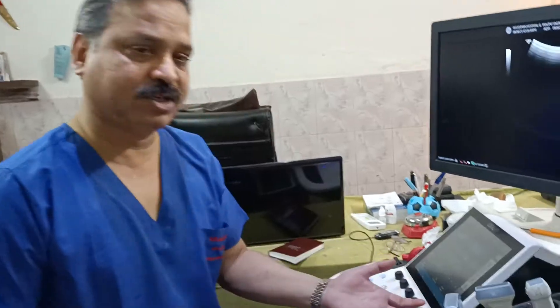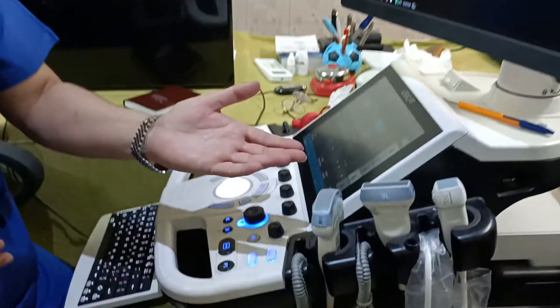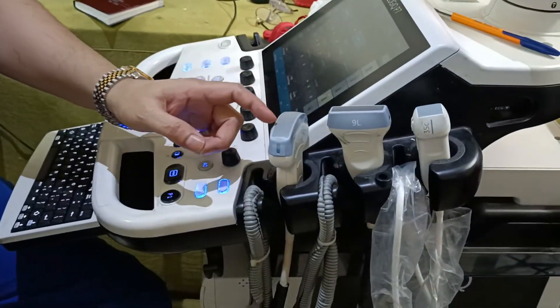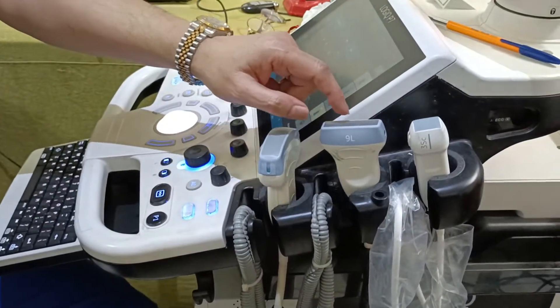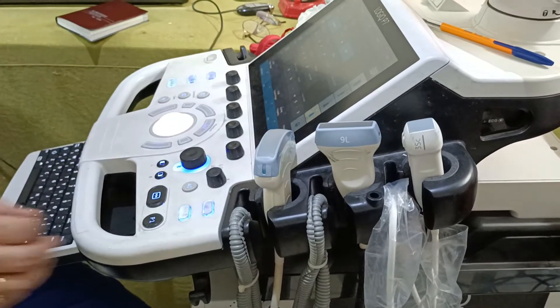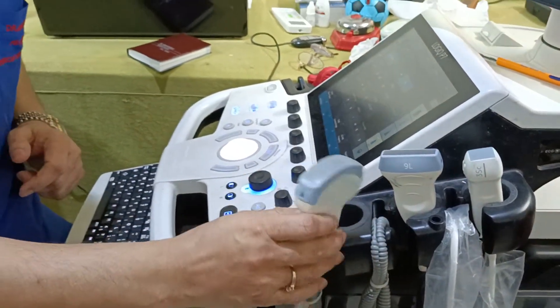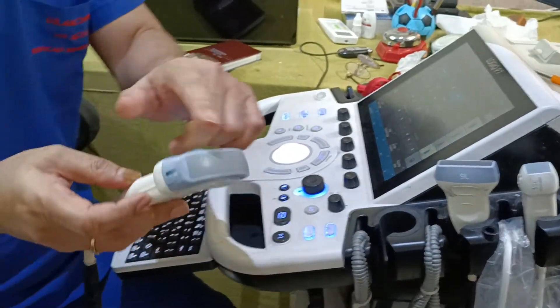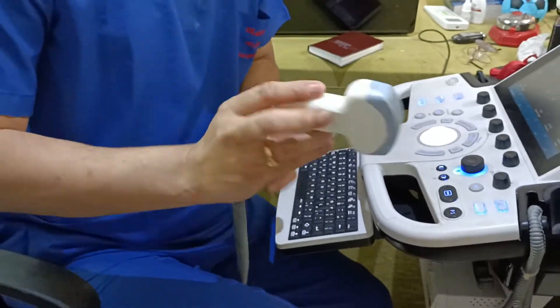Now coming to the probe selection: we will be using the convex probe, and for the pleura we can use the linear probe, but for the abdominal scan we can use the convex probe.